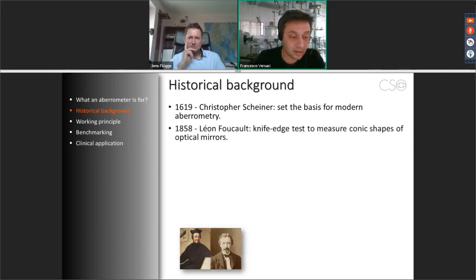In 1858, Jean-Baptiste Léon Foucault announced his knife-edge test to measure the shape of conic optical mirrors. We have to recall this because our optical principle is actually derived from the experiment of Foucault.